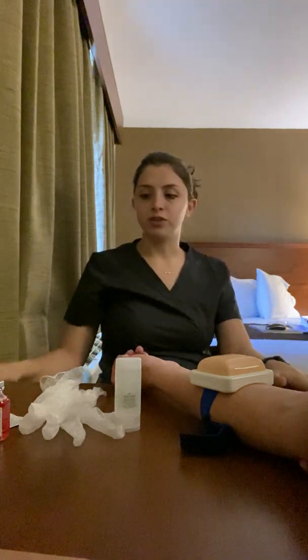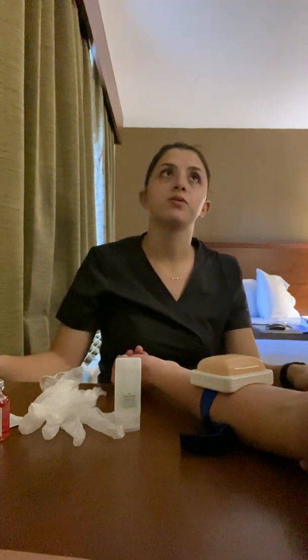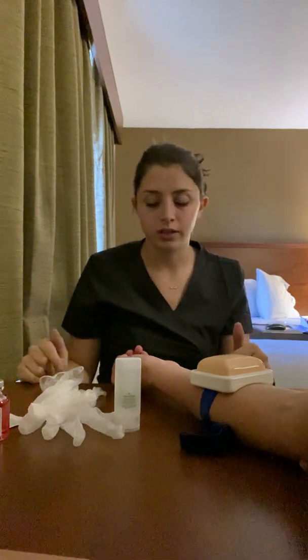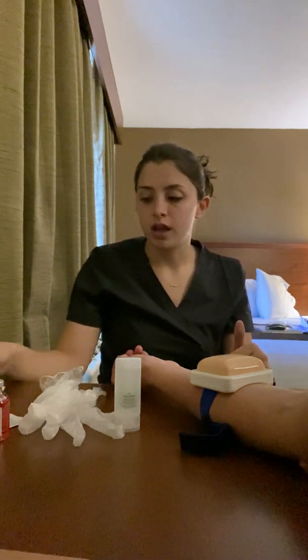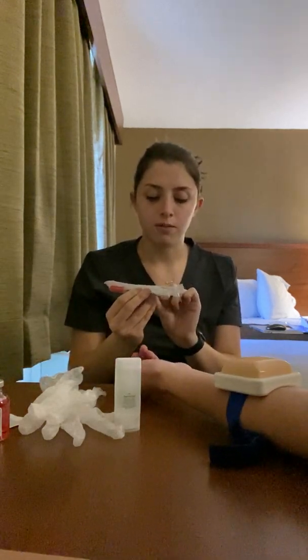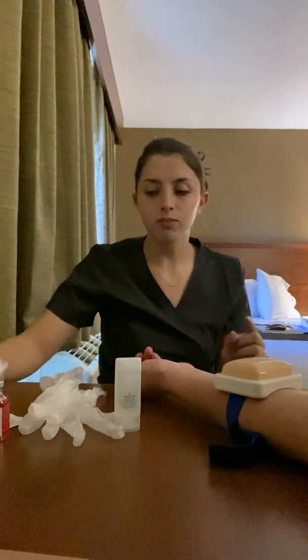So now I'm going to calculate the right dose. So the order calls for 0.1 milliliters. On the medication, it's 5 TU per 0.1 milliliters, so I'll only be doing 0.1 milliliters. I'm going to be using a tuberculin syringe with a 25 gauge needle and a 5/8 of an inch needle.